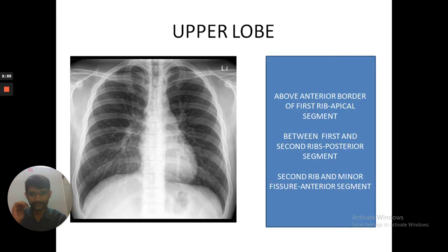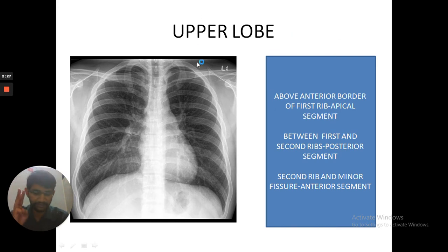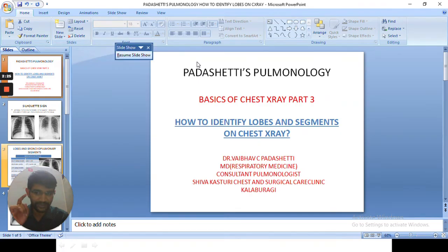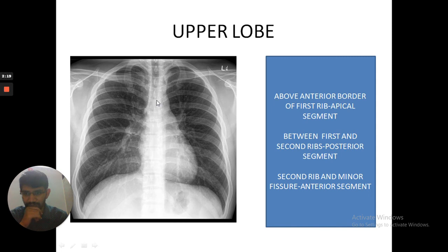Other than the silhouette sign, how else can we identify lobes and segments? There are three segments in the upper lobe: apical, posterior, and anterior. We are going to study how to identify these three different segments.